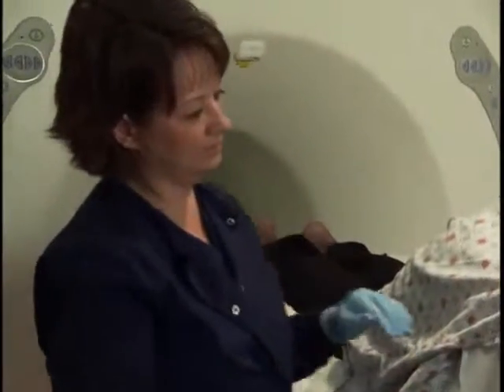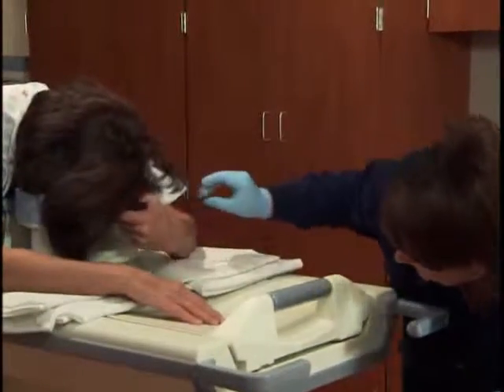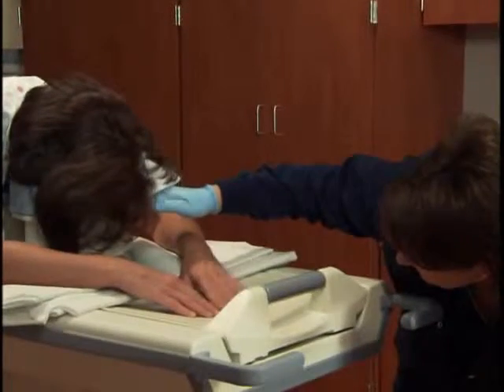Place cushions under their arms, a mirrored head holder to decrease claustrophobia, and provide an emergency panic button.